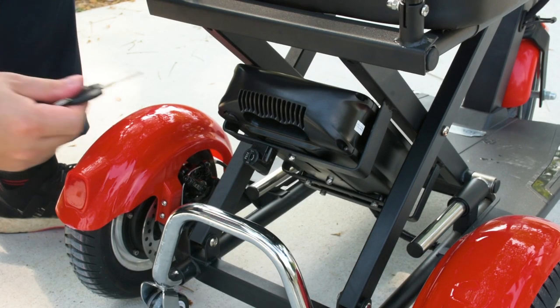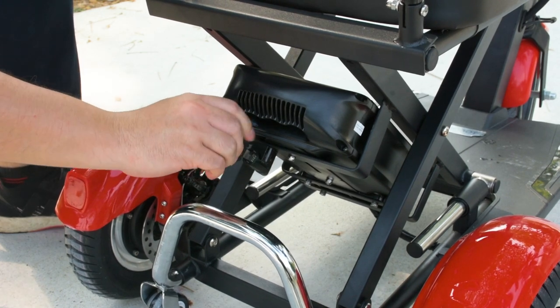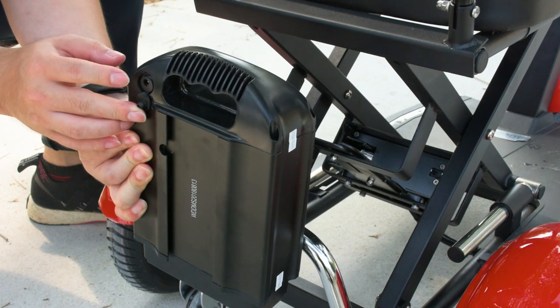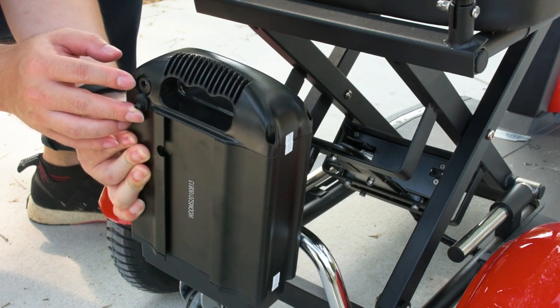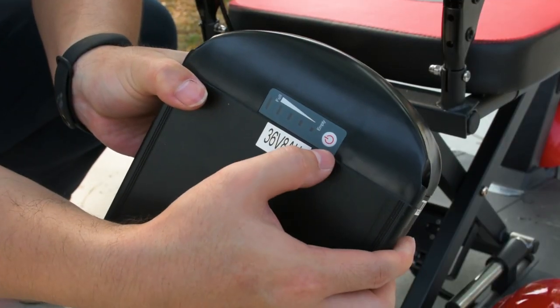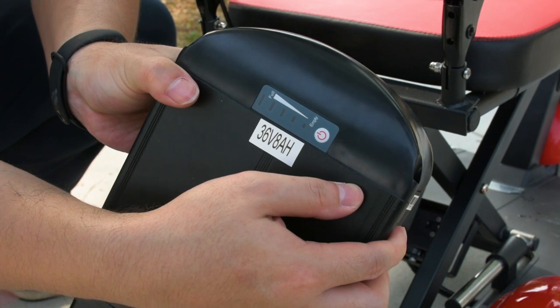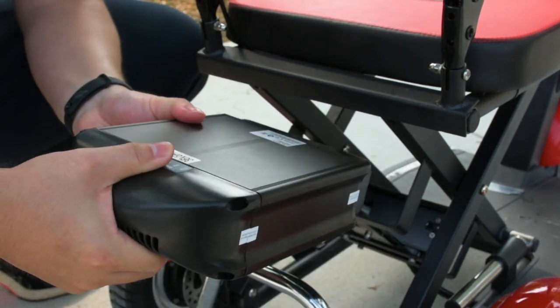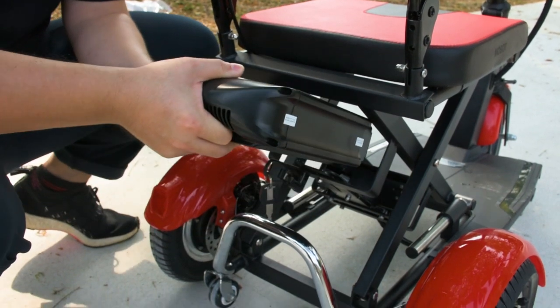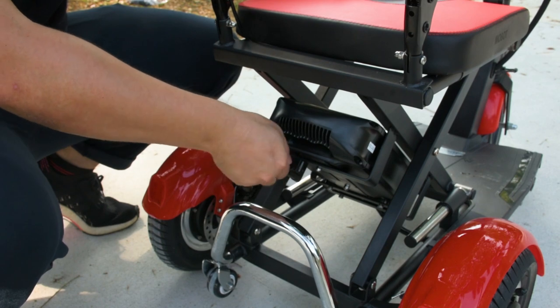The battery is detachable and can be removed from the Flexi Pro by using the key provided to unlock it. This is the charging port, and you can charge the battery either separately or while it is connected to the Flexi Pro. The opposite side of the battery has a battery indicator that shows how much battery is left when you click the power button. When connecting the battery back, remember to align the grooves under the battery to the grooves of the battery compartment to attach it correctly, then lock it back in place with the key.